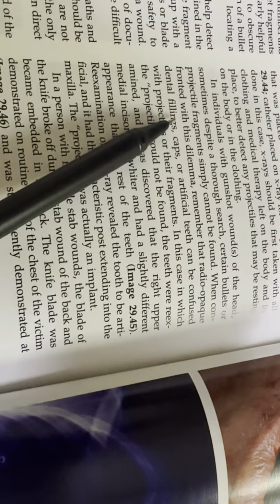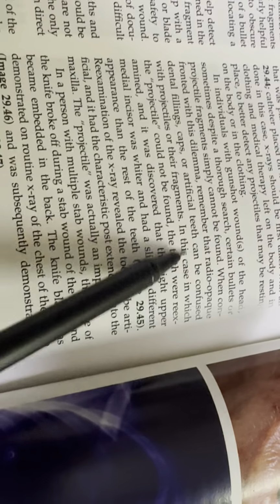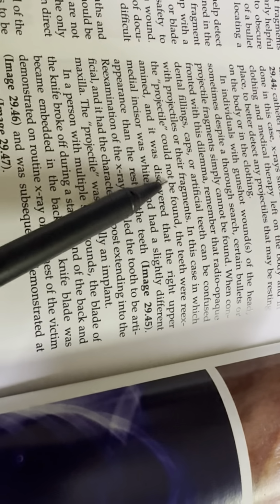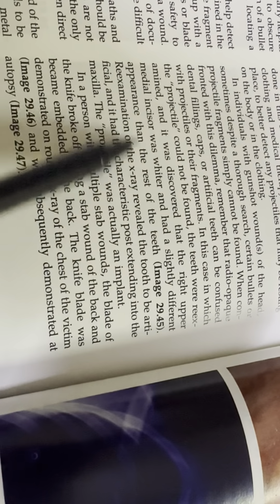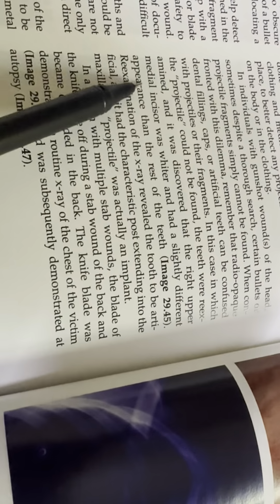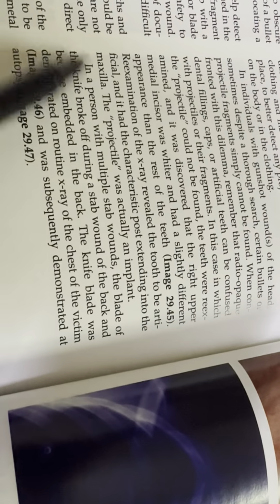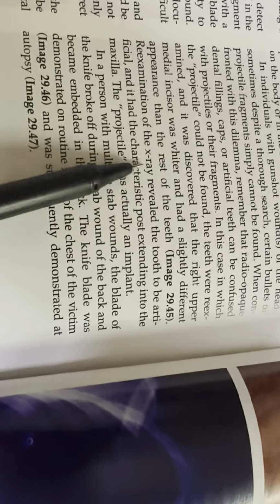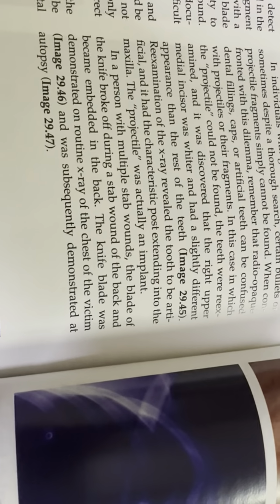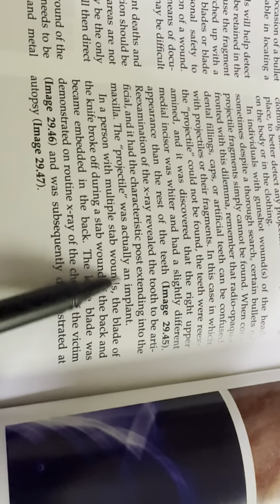When confronted with this dilemma, remember that radio-opaque dental fillings, caps, and artificial teeth can be confused with projectiles or their fragments. In this case, in which the projectile could not be found, the teeth were re-examined and it was discovered that the right upper medial incisor was whiter and had a slightly different appearance than the rest of the teeth. Re-examination of the X-ray revealed the tooth to be artificial, and it had the characteristic post extending into the maxilla. The projectile was actually an implant.